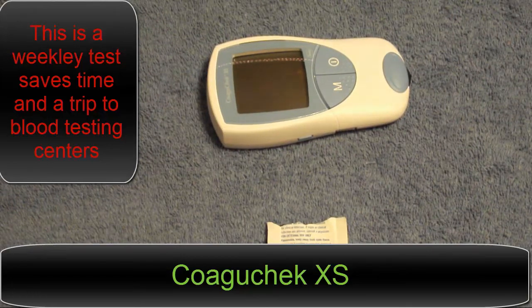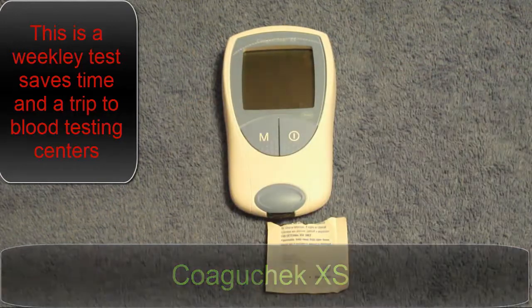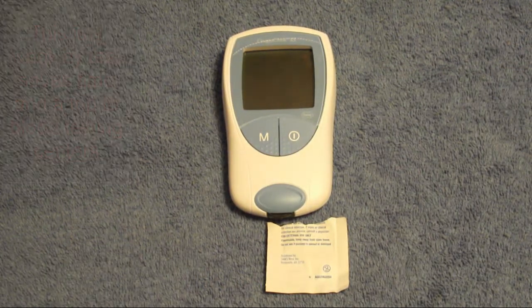To anybody that is on blood thinners, this is a nice machine that I would suggest you talk to your doctor about and see if you can request it. Some insurances pay for it. Ours happens to pay for it 100% — it doesn't cost us anything.